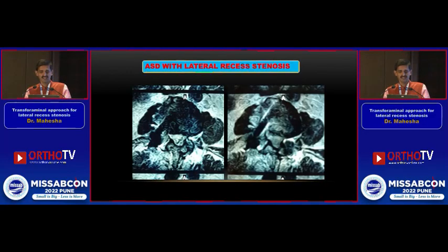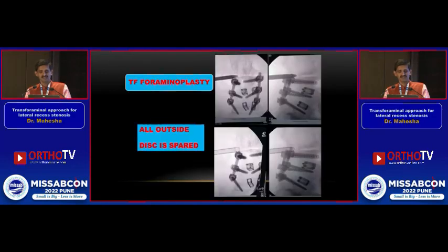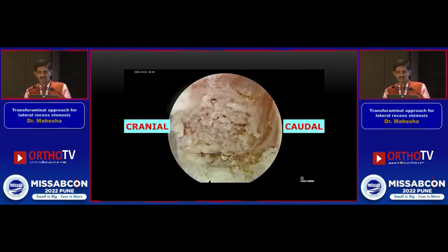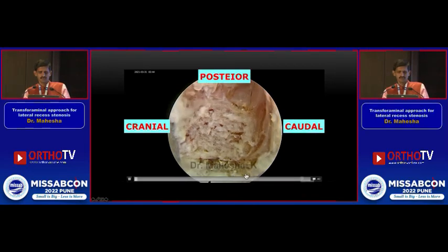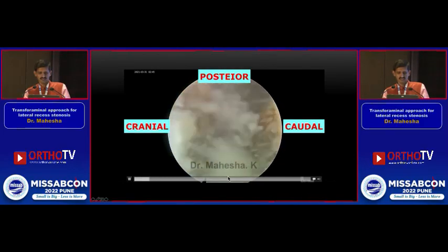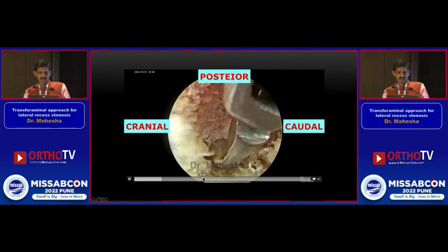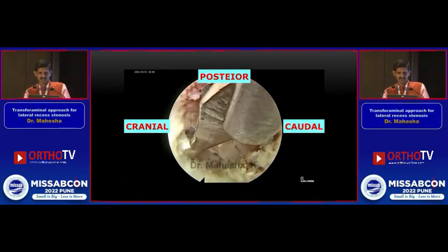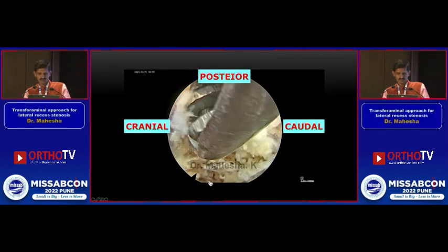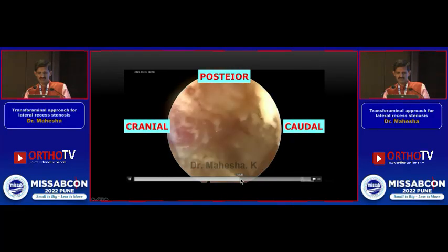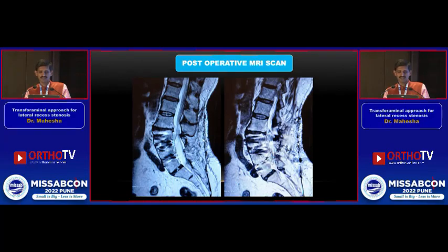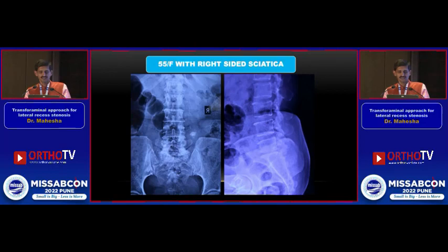I will show two or three cases. This is adjacent segment degeneration in an elderly lady with very severe right-sided pain. Endoscopic decompression was done; the disc was not entered. This is the facet which we are drilling. Medial to the facet is the root. I am using a curette here because this is an elderly osteoporotic patient. We have to remove the ligamentum flavum — once you remove it, you can see both the exiting and traversing roots very clearly. This is the post-operative MRI. The patient had excellent relief and did not require any revision fixation.